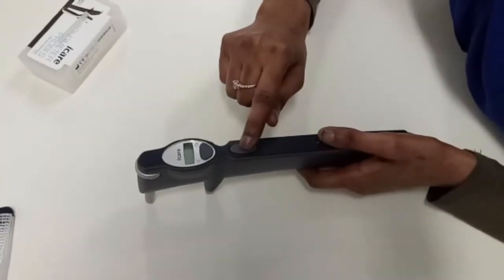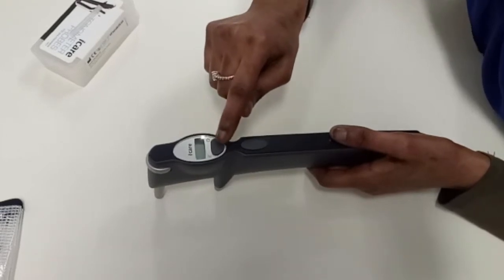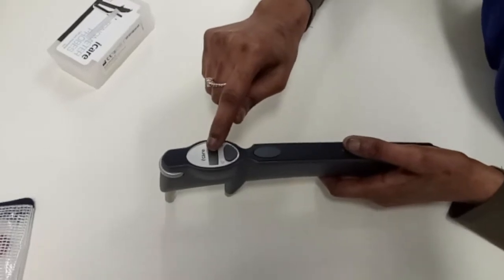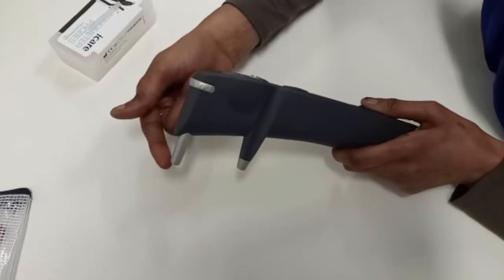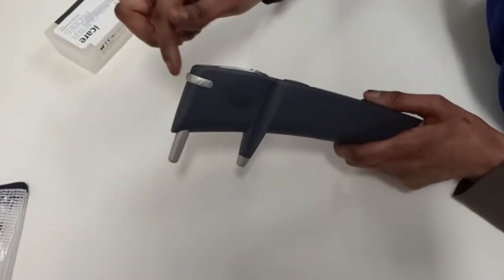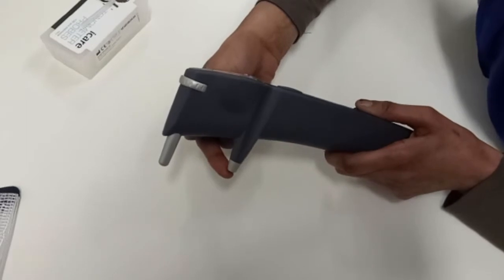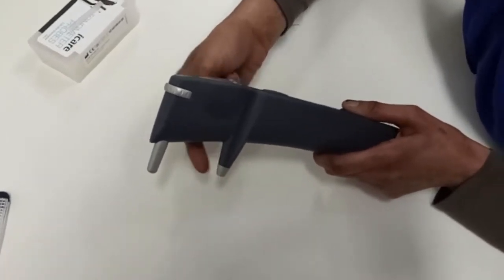The orthoptist here is demonstrating the measurement button, which is also used to turn on the tonometer. Second is the selector button. Third is the display area. This is the forehead support, and this is the adjustment wheel, which is used to adjust the forehead support so the tip of the probe is placed at 90 degrees to the front of the eye. That is where the probe is inserted.